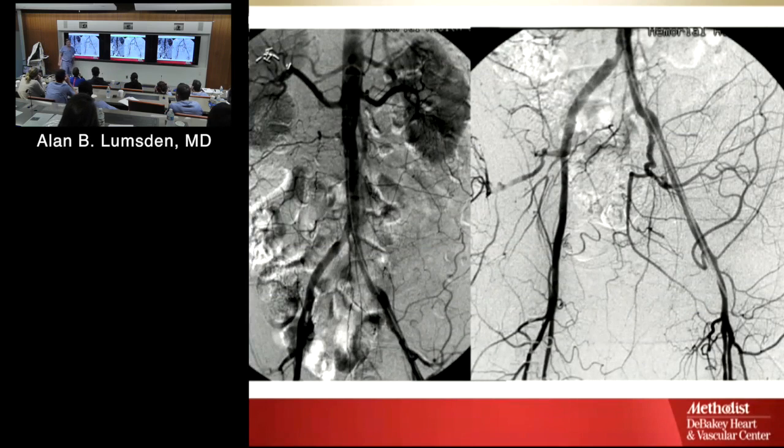What angle is this on the image intensifier? Oh, now we're getting tricky, huh? Who's up? I don't know where we stopped. Honesty is a good policy. Go ahead, you're up. You look guilty, so you get the question.